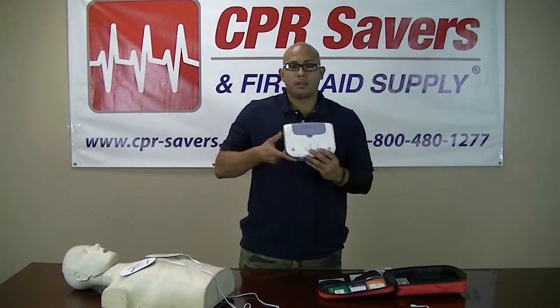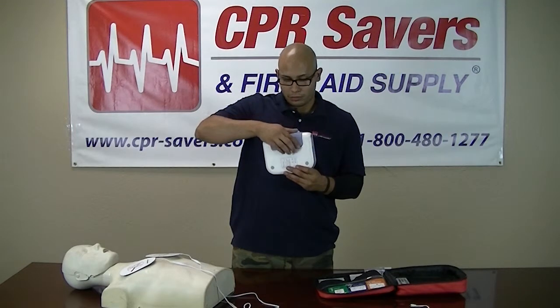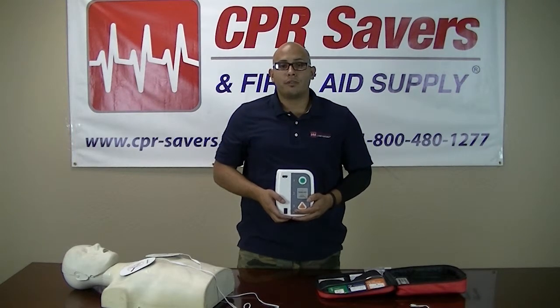On the back you will find the battery compartment along with the scenario module. Language modules come in many variations and can be purchased for an additional fee.